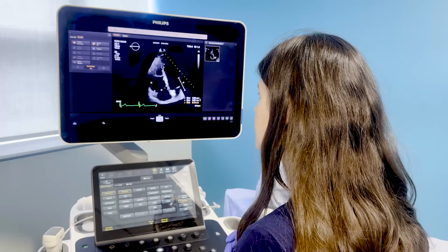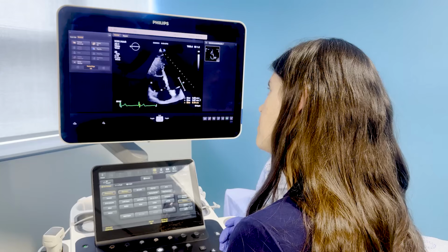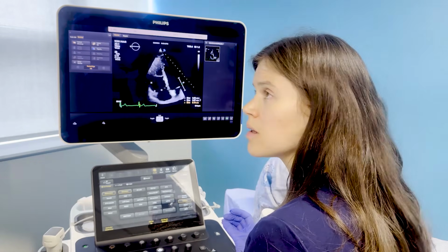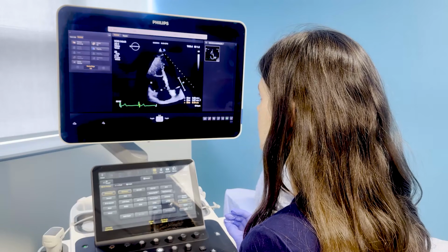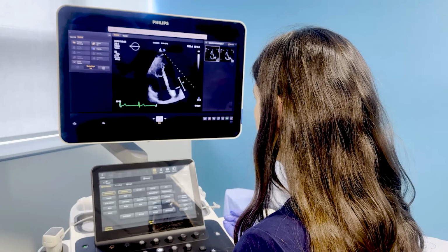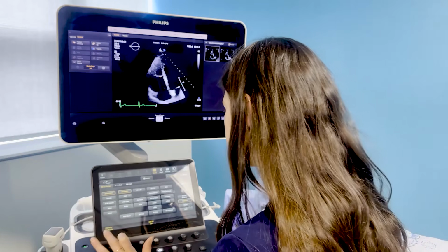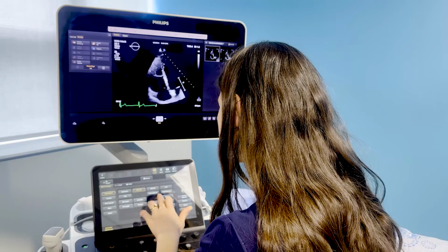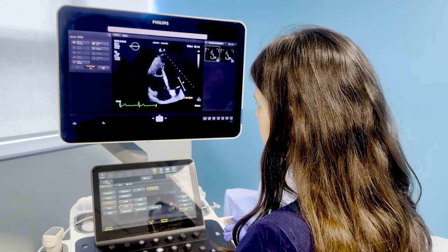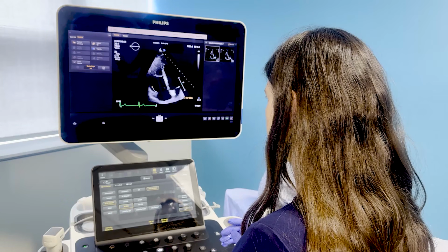Okay, so you don't normally do RV end systolic area and end diastolic area, is that correct? Or do you do that with every echo? Correct. No, we aren't currently doing that in our lab. Okay. That's something we can begin to work on. Should we try doing that here? Sure. So again, I would go to end diastole. So this is the RV end diastolic area. Exactly.